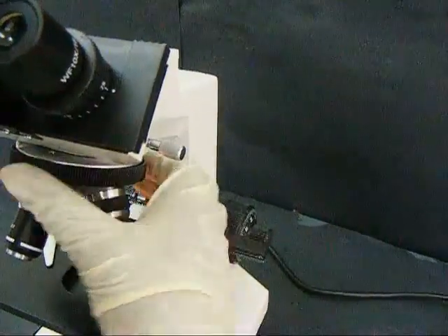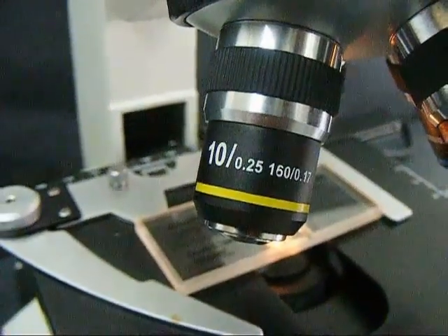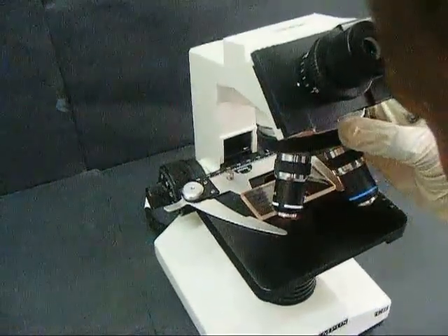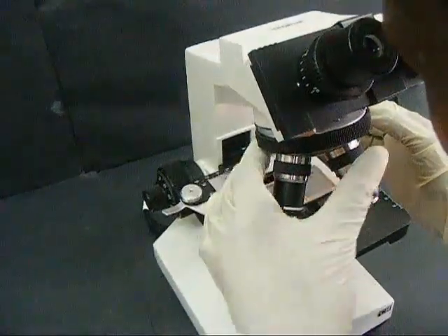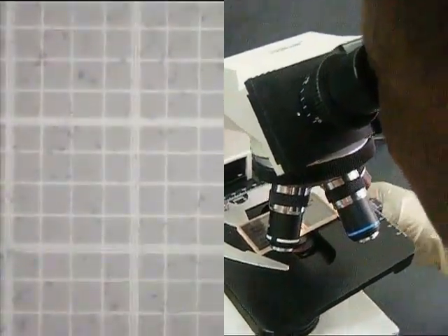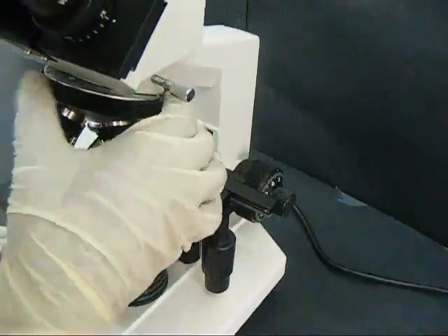At the objective magnification of 4x, the counting chamber is brought into focus. At the objective magnification of 10x, the red cell counting area is seen prominently with tiny red blood cells. At the objective magnification of 40x, the red blood cells are very visible and suitable for counting.